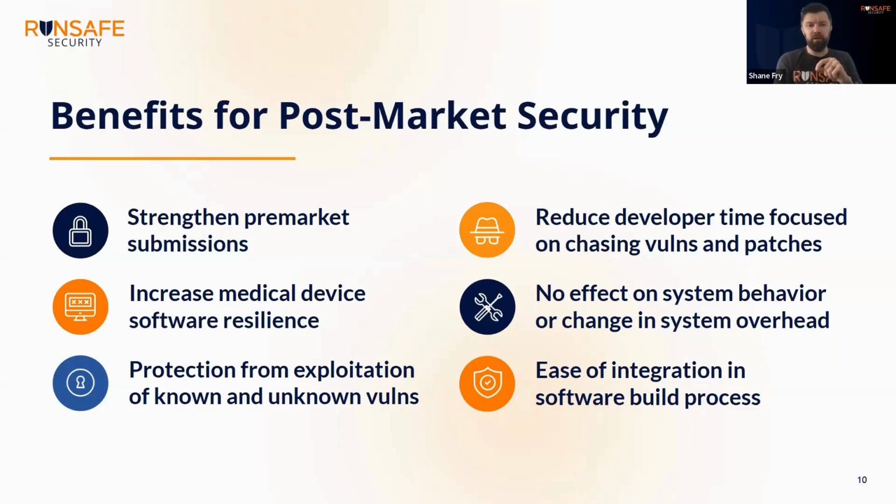But as you start to think about it, you said these devices are going to people's homes. They're connecting to people's phones and laptops and Wi-Fi networks. Those are all places where the average person isn't as cyber aware as a hospital might be, which isn't even as cyber aware as most cyber practitioners are. So there's a whole lot more exposure there. And you mentioned devices that might be implantable in a person. If you're just walking around and someone can attack your pacemaker in the middle of New York City, that's a bad day, right? So there's a lot of value in being able to protect devices, especially as they're leaving those kinds of secure perimeters.